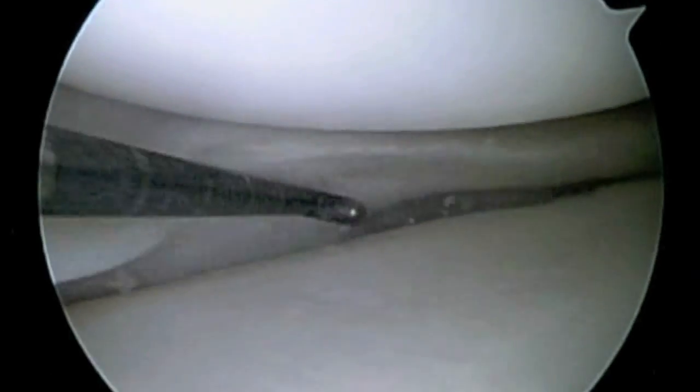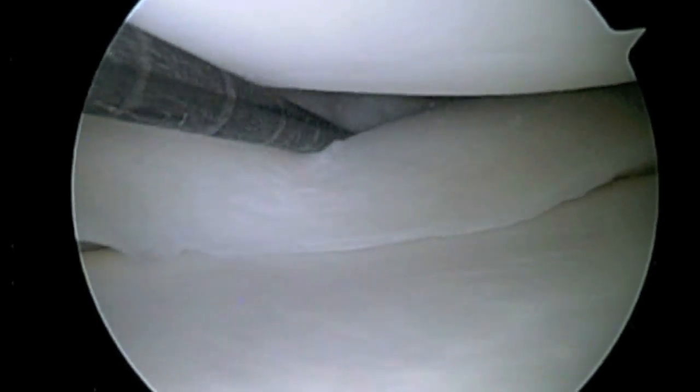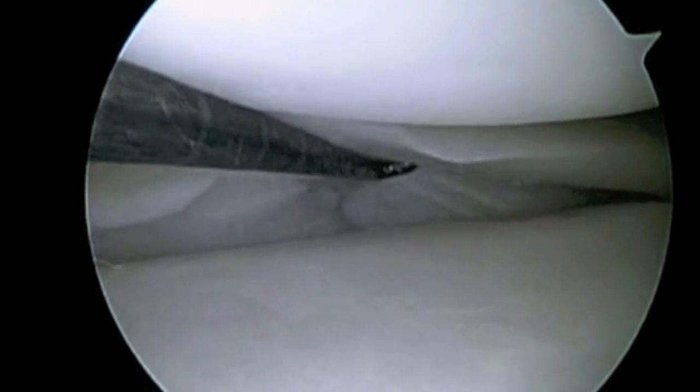This is a view of a torn medial meniscus. The meniscus is a shock-absorbing cartilage in the knee. The probe is within the tear. This is an unstable tear occurring at the periphery or outer portion of the meniscus where there is a blood supply.